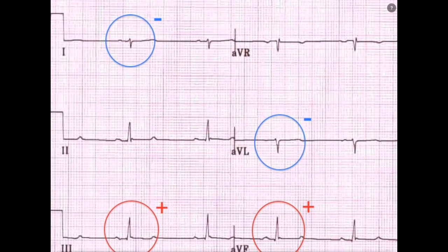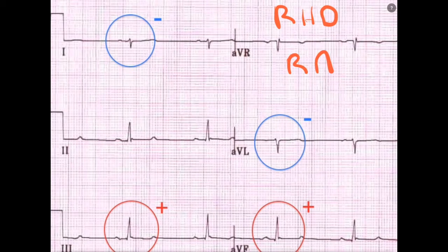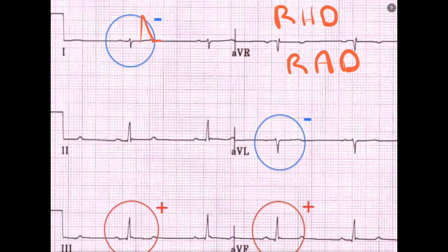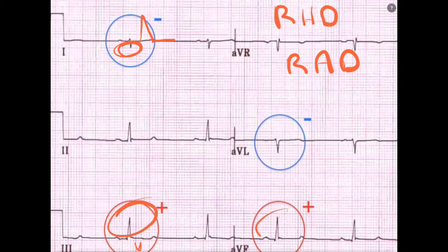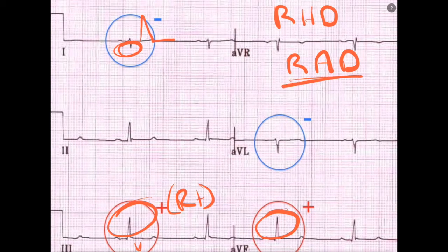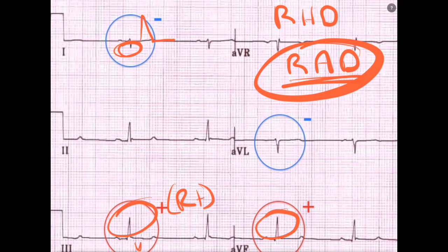Another classic finding is right axis deviation. This is evidence of strain on the right side of the heart, because the clot is stuck in the lungs and the right side is trying to push blood past it, getting strained and dilating. So normally lead one is mostly upright in a normal person, but now it's mostly negative. And lead three, which used to be mostly negative with a normal left axis, is now upright. The leads pointing to the right side are mostly upright — that's right axis deviation, suggesting strain and dilation on the right side.